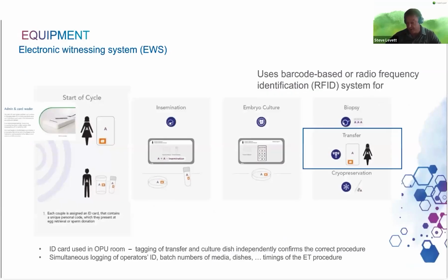I'm not going to dwell on witnessing, but it's a key factor, again, that we need to ensure. The embryo transfer is a very sensitive time. It's perhaps even more so than at egg collection, where the patient is maybe under the influence of the pharmaceuticals that we're giving them and concerned about the egg collection procedure itself. And at embryo transfer, they're very much engaged in what's going to happen. And so identifying them and the embryo, etc., is extremely important. But we know that manual witnessing has its limitations.